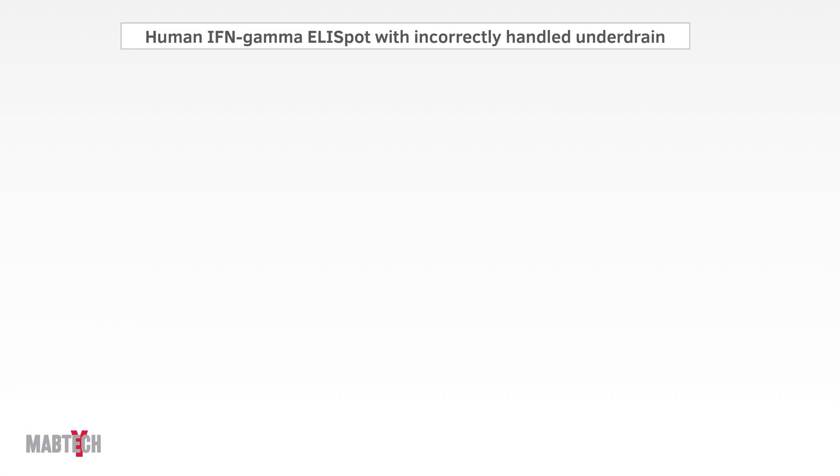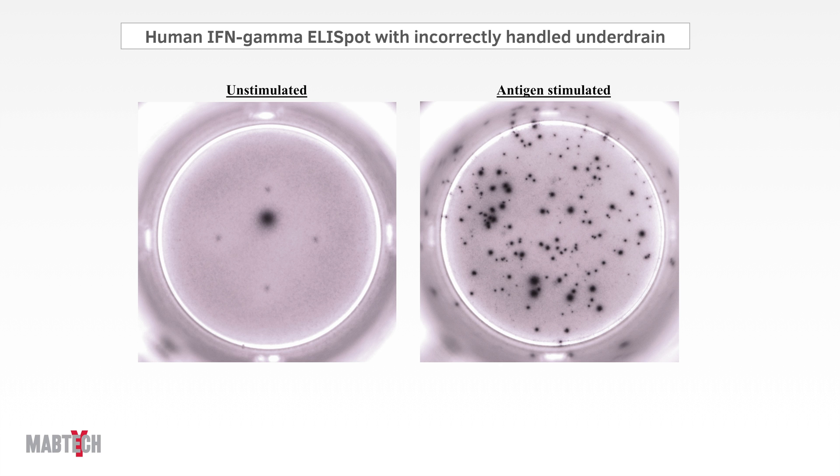Let us together check out some real-life examples of typical underdrain-induced artifacts. Here we have two images of a human interferon-gamma ELIspot that has these typical signs or hallmarks of an ELIspot plate that has not been handled correctly.